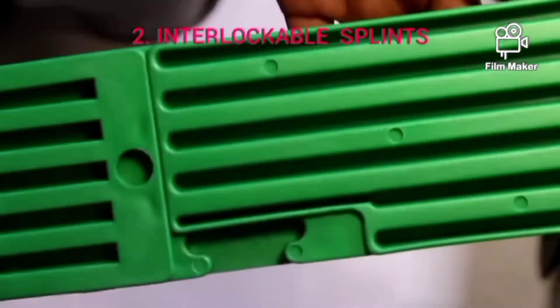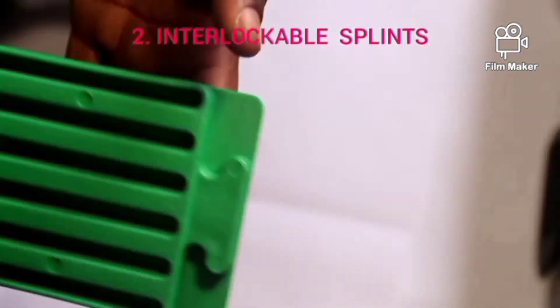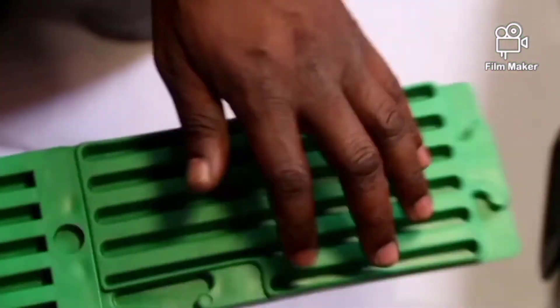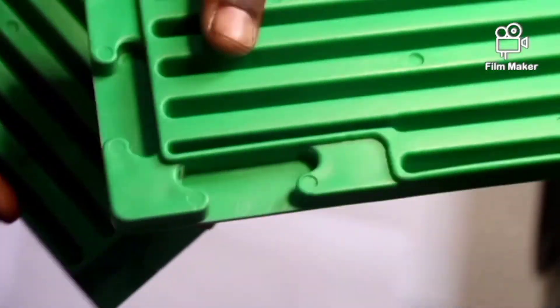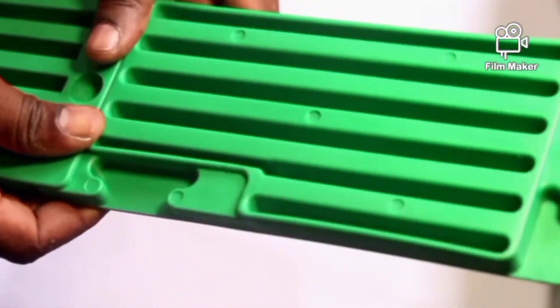These are interlockable splints. They are called interlockable because, as you can see, they are separate pieces — this is a piece, this is a piece, and this other one is also a piece. They have been joined here and you are able to join them as locked. So you can lock them by fixing them like this.